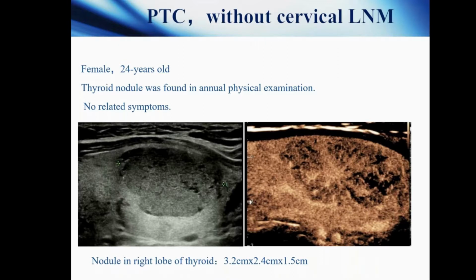However, high enhancement with some irregular perfusion defect areas was found on the contrast ultrasound, and an irregular high enhancement ring surrounding the mass was displayed. So the CEUS result is malignant.